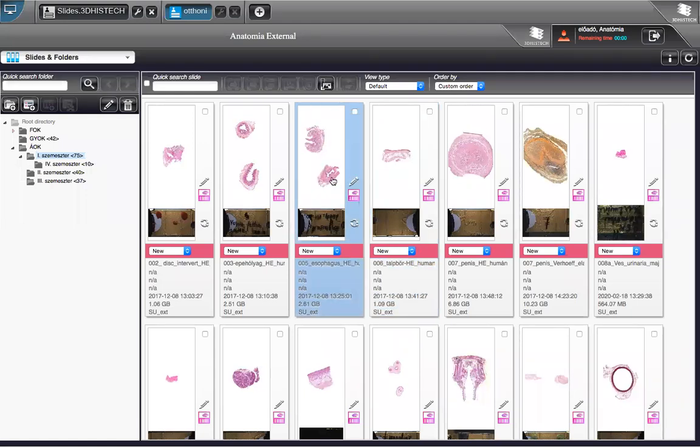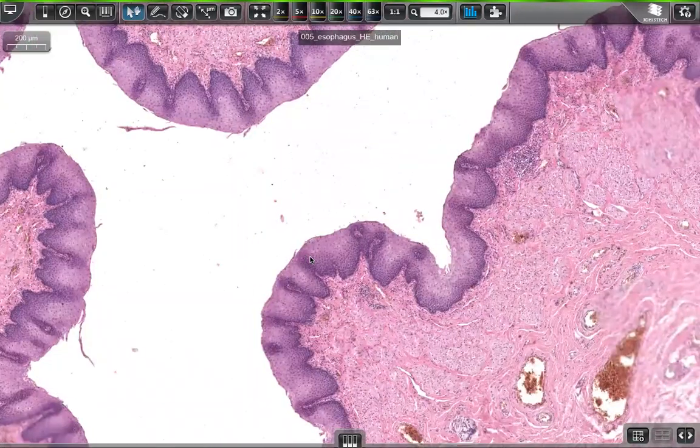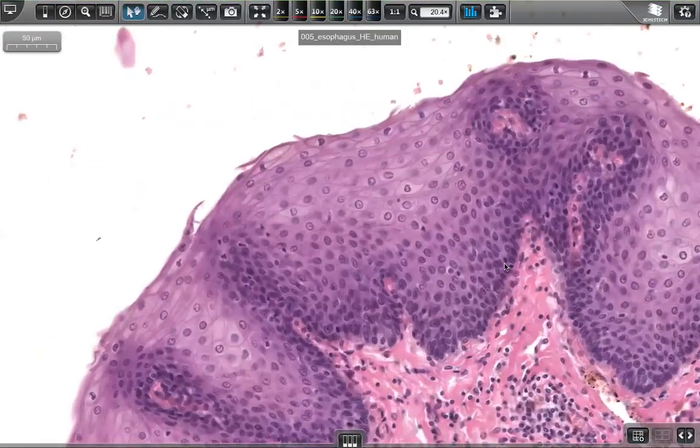In the esophagus, there is another type of epithelium. So stratum basale here, stratum spinosum or polygonale, and at the top the compressed layers. These are part of the stratum planocellulare. So that's the stratified non-keratinized squamous epithelium, what we can see in the esophagus, oral cavity, surface of the tongue, vagina, so this area.